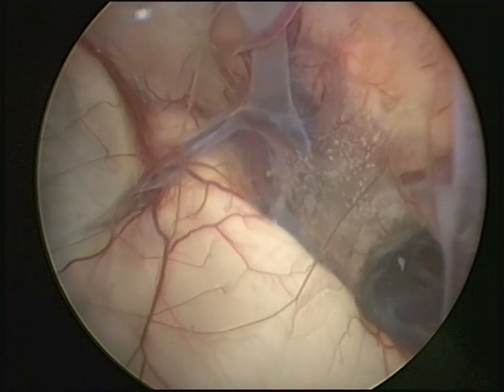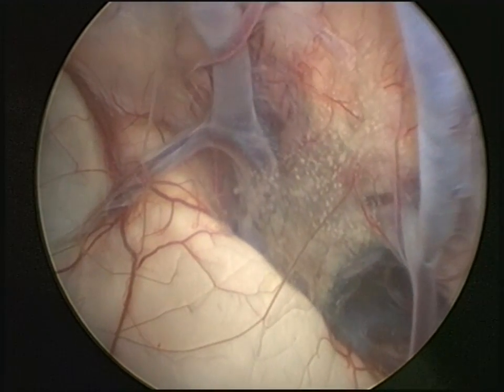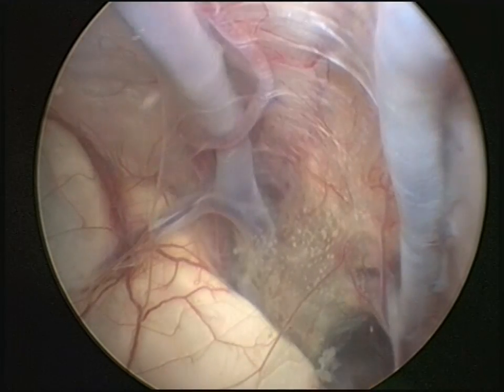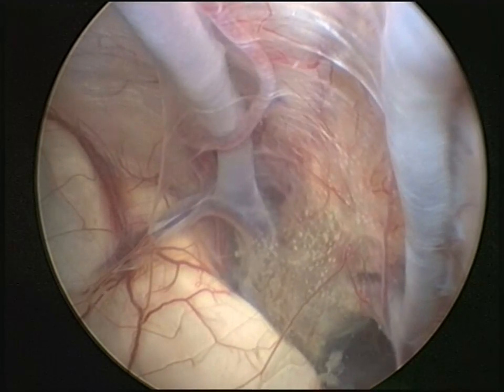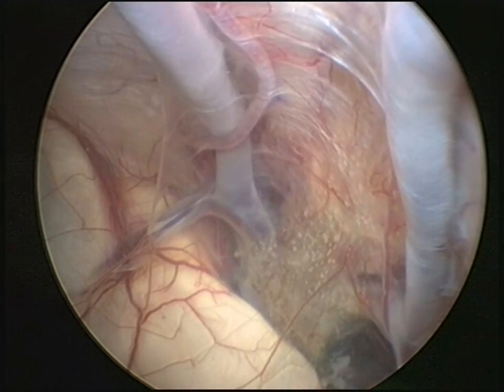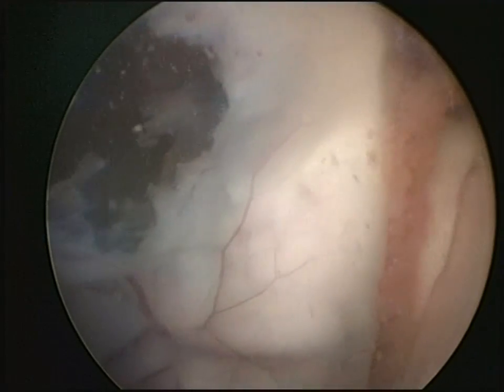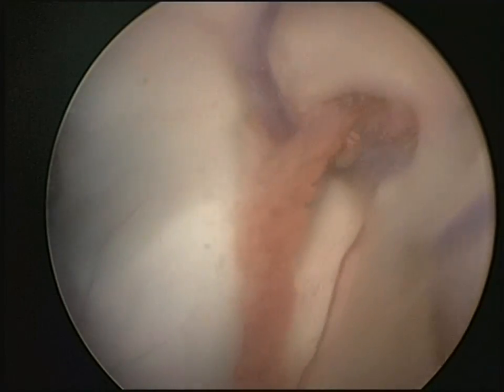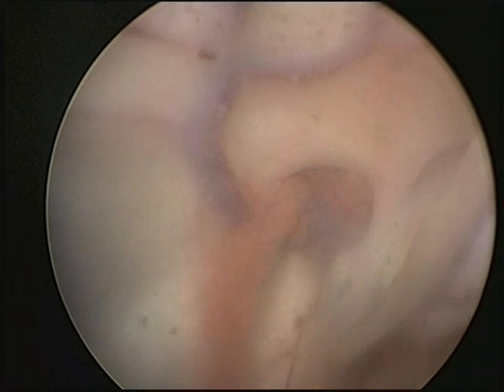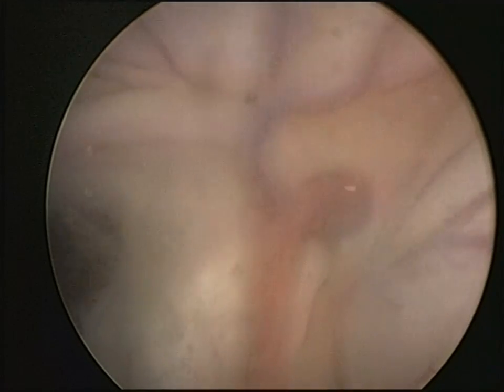The inspection using the 30-degree endoscope shows the roof of the third ventricle with the internal cerebral veins and the choroid plexus, as well as the splenium of the corpus callosum. On conclusion of septostomy, the endoscope sheath is removed from the right ventricle under endoscopic visual control.